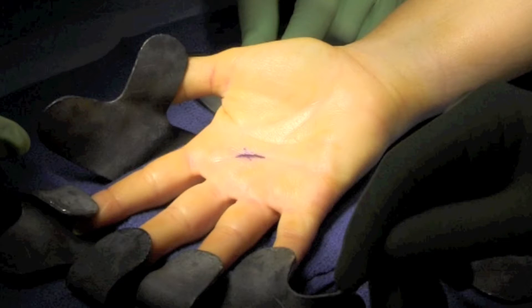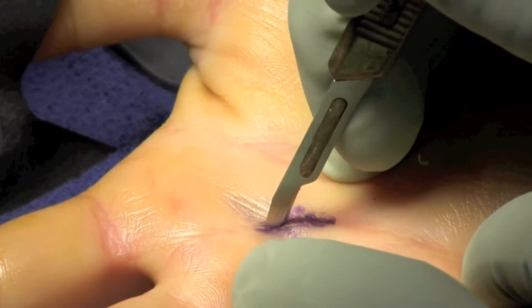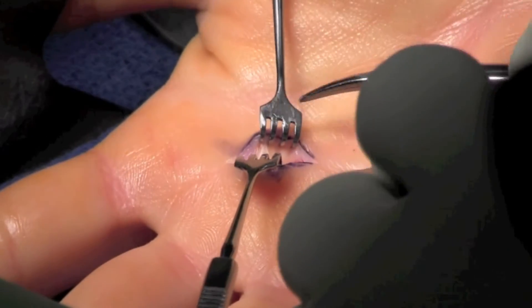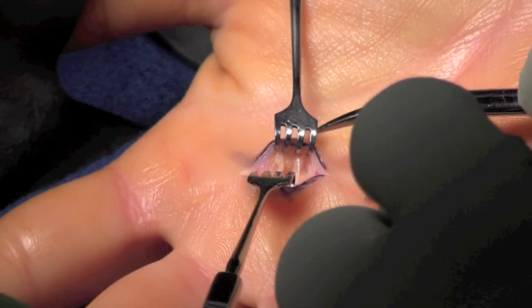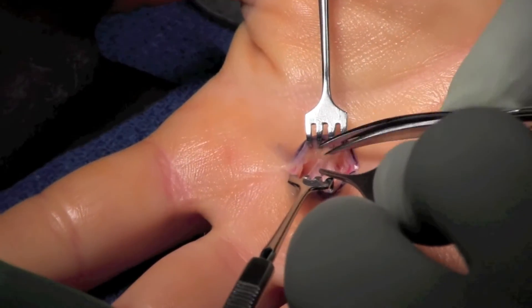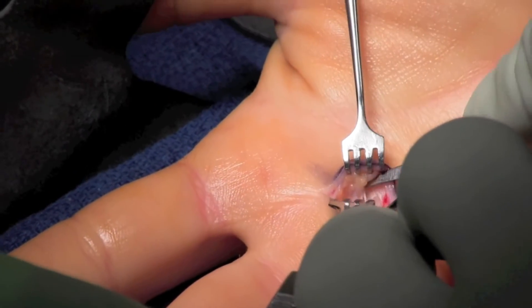Here we have an illustration of an oblique incision line, which is made using the flexor crease in the mid-portion of the hand. Skin and subcutaneous tissue is divided. We use cat's claws here to elevate the subcutaneous tissue, and then we enter the retinacular tissue. This is transected with our goal now to get down to the flexor tendon sheath.